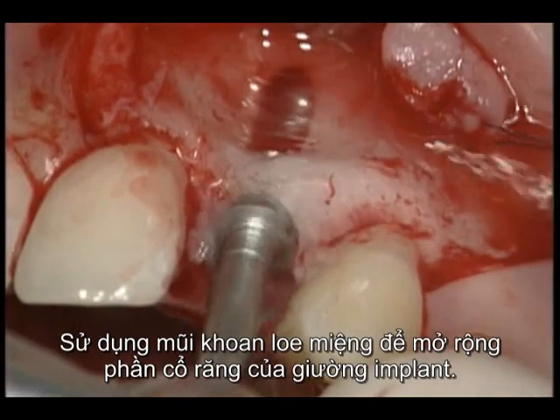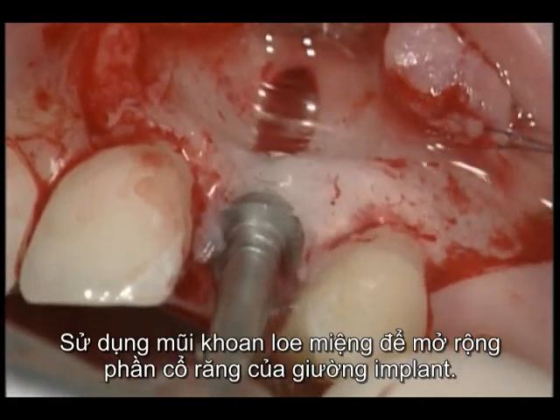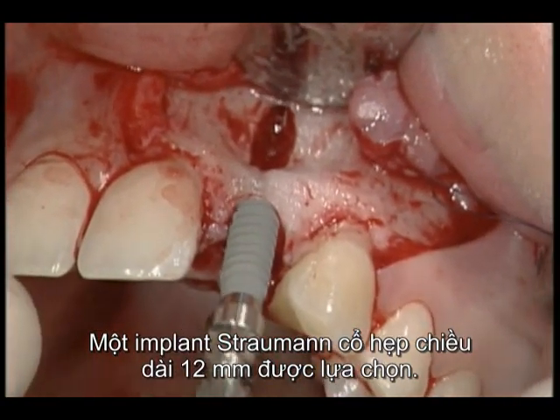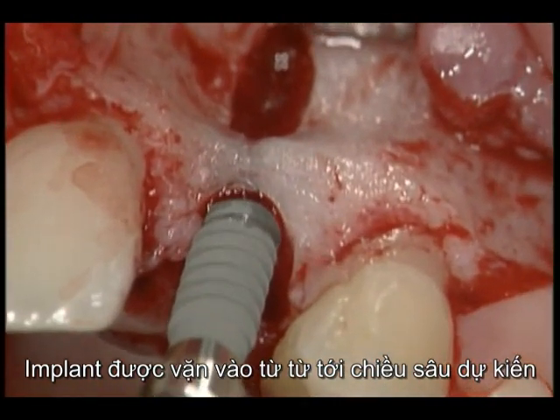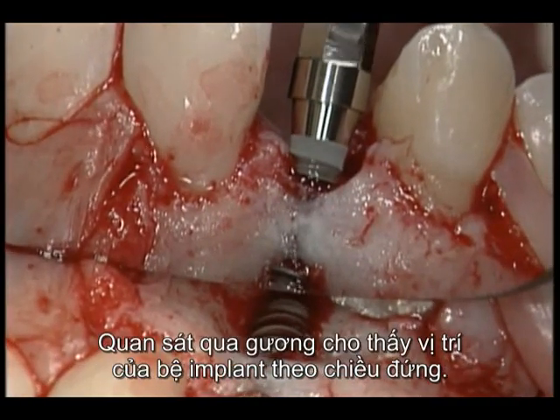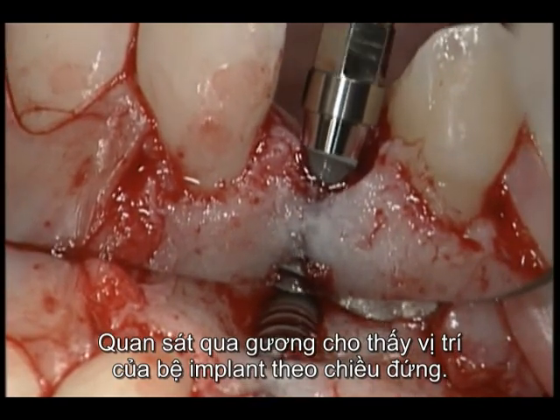A profile drill is used to prepare the coronal aspect of the implant bed. A 12 millimeter Straumann narrow neck implant is now selected. The implant is slowly inserted to the correct depth using a contra-angle handpiece at a speed of 15 RPM. The mirror view shows the vertical position of the implant shoulder.